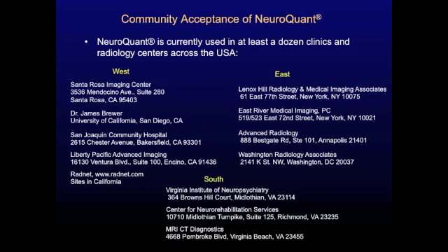Okay, regarding the community acceptance of NeuroQuant, NeuroQuant is currently used in at least a dozen clinics and radiology centers across the United States. So it's been catching on and it's becoming more and more commonly used.